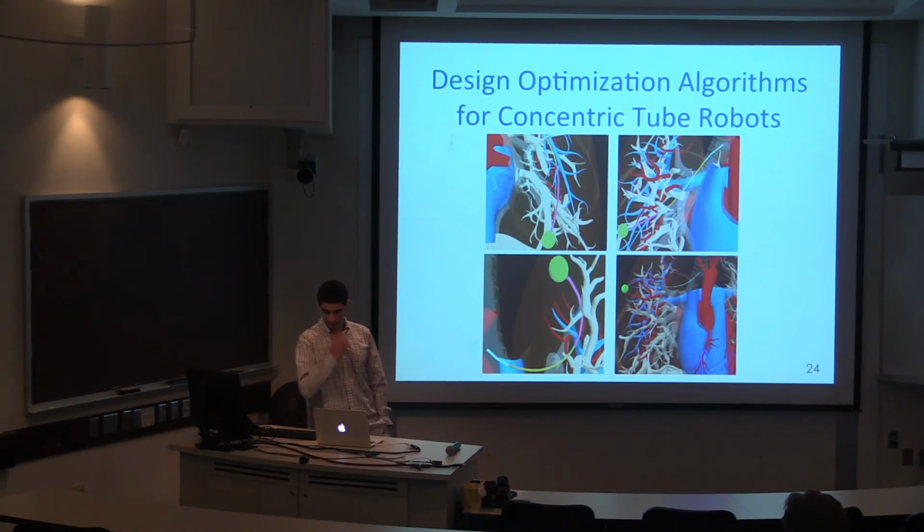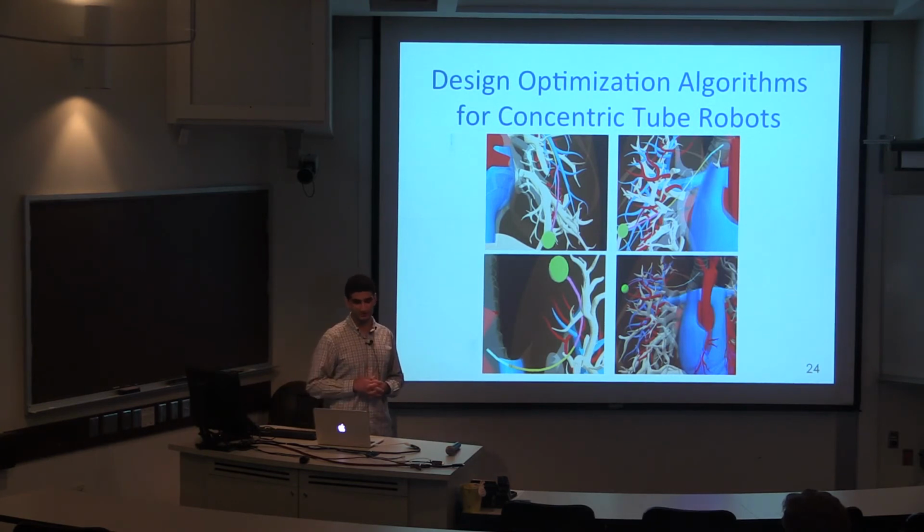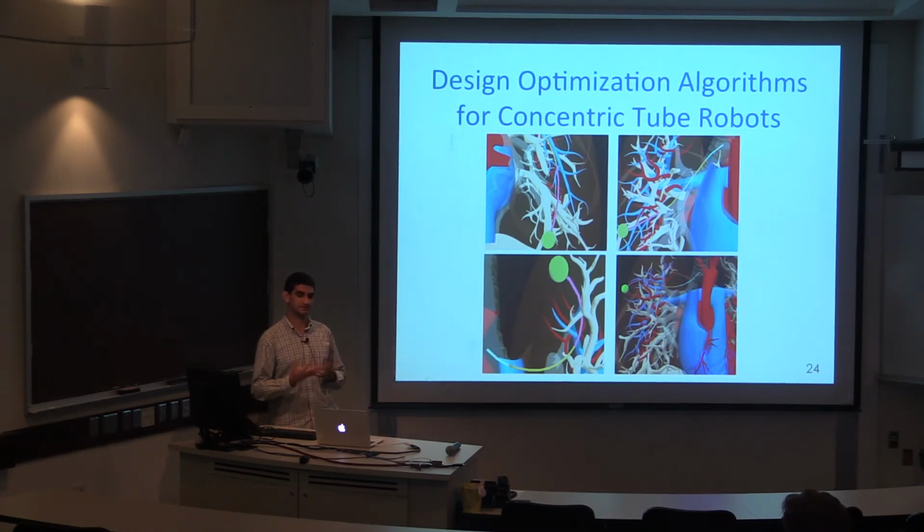So that's a great question. As I mentioned, our design optimization algorithm takes into account the anatomy of a patient. And as you clearly pointed out, the anatomy can be different between patients. For instance, if you consider the lungs of a child, that will be much different than the lungs of a grown person. So there might be some severe variation, but we haven't really looked into how much variation there really is. But we anticipate, due to variances in humans in general, the anatomy could be quite different. Hence the application and patient-specific part of our optimization.